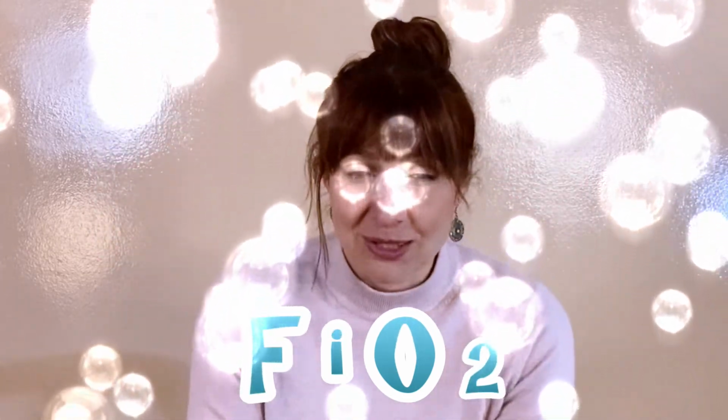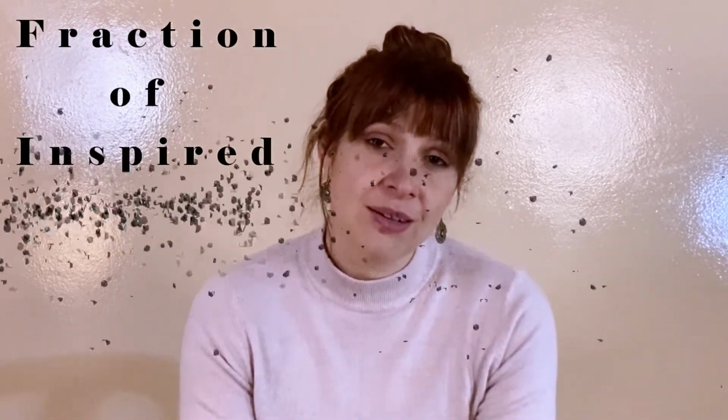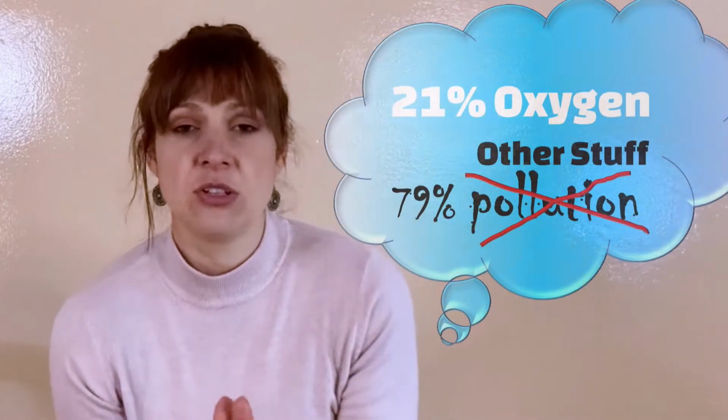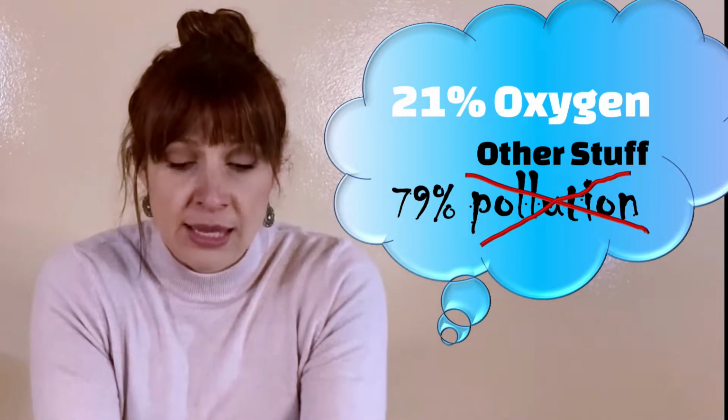Right, so now that you've got that under your belt, we can talk about the first point of ventilation, FiO2. Now, that might sound complicated because it's got letters and numbers in it, and immediately you're thinking about maths, but actually it's really simple. It stands for the fraction of inspired oxygen. If you're still unsure, let me translate. It is the percentage of oxygen that I'm breathing in. So in the air around me, the percentage of oxygen that I'm breathing in is 21%. If I'm ventilating somebody and giving them air, that can be anywhere from 21%, you don't want to go lower, all the way up to 100%.